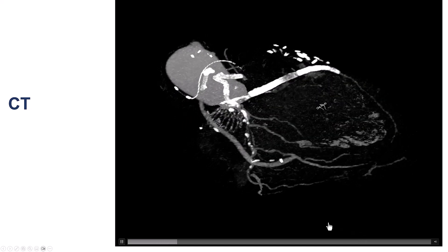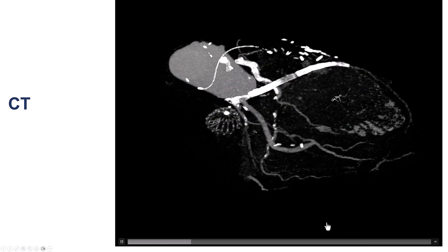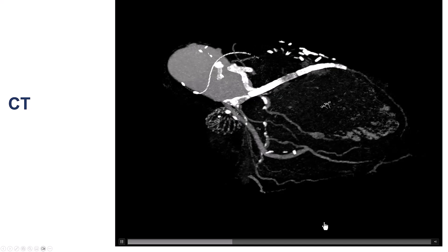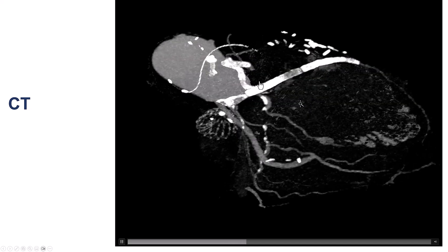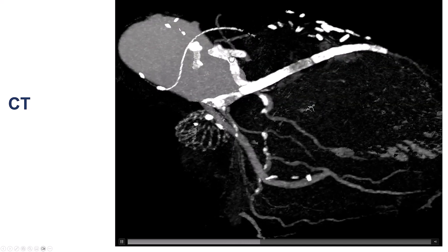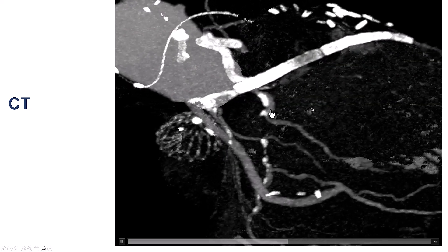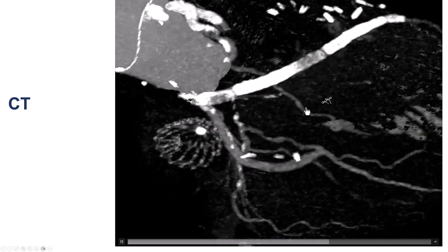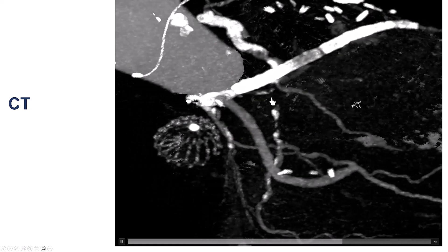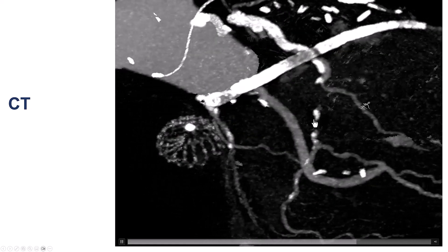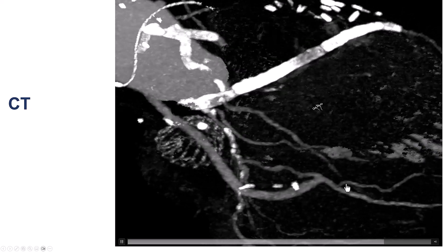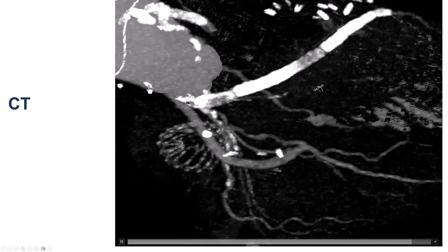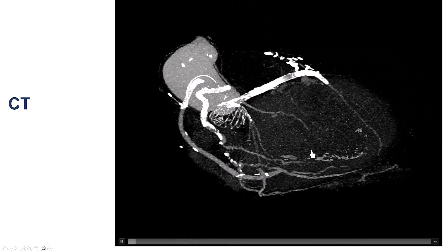For planning, we performed coronary CT angiography, which can be extremely useful in cases that are complex like this. What we have here is a heavily calcific right coronary artery. This is the proximal cap, this is the acute marginal, this is the occluded segment, this is the distal vessel at the bifurcation, and this is the saphenous vein graft that feeds the PDA.